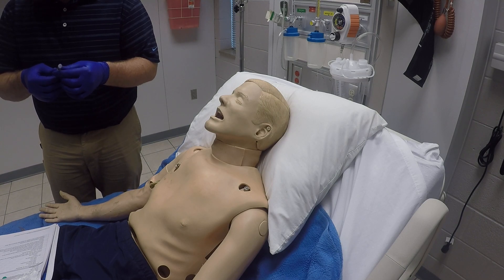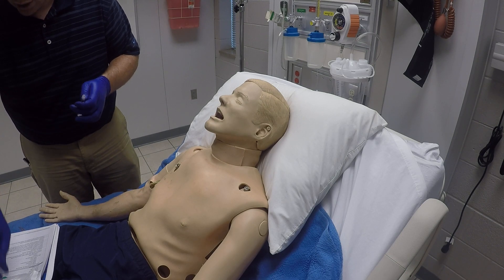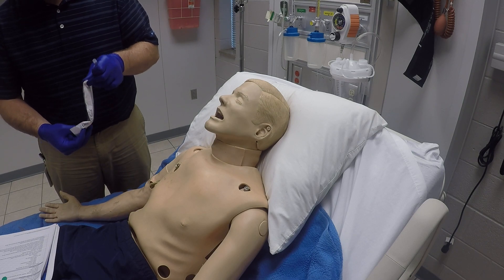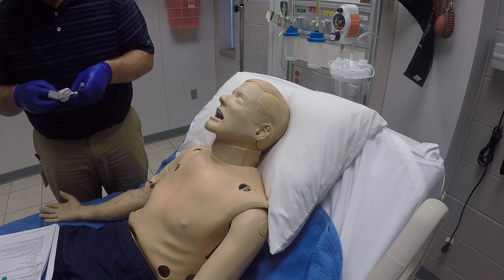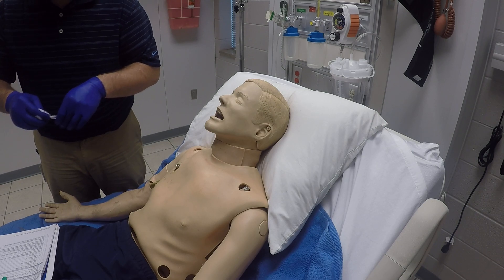Go ahead and recheck our medication — we do have half a milliliter here and make sure it is still the right medicine that we need. Of course, we've got our PPE on through all this. We're keeping the tip of our atomizer nice and clean and then go ahead and screw that on.